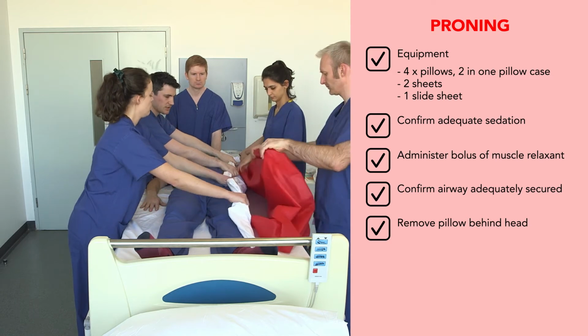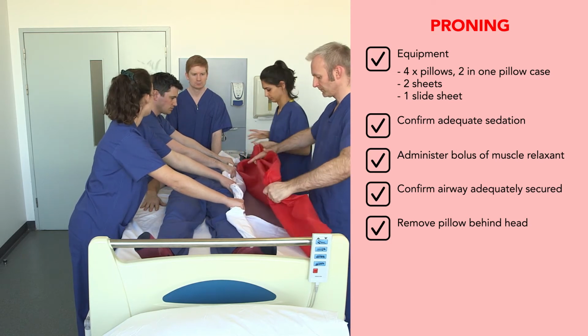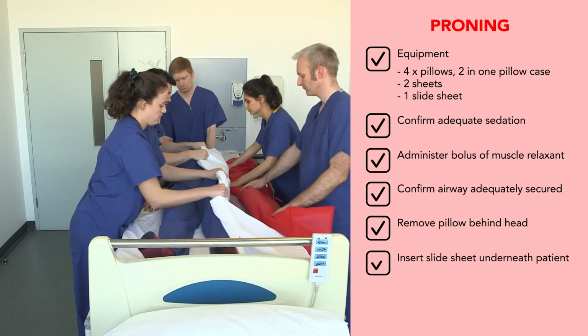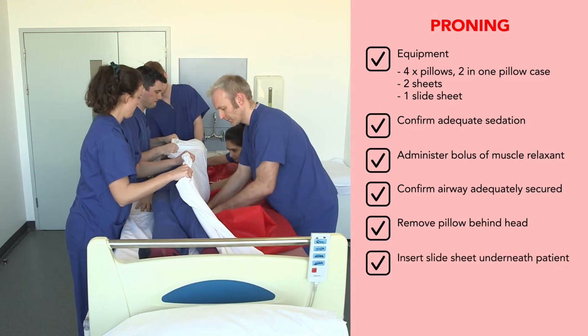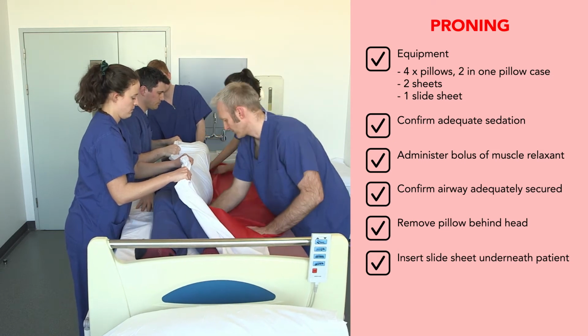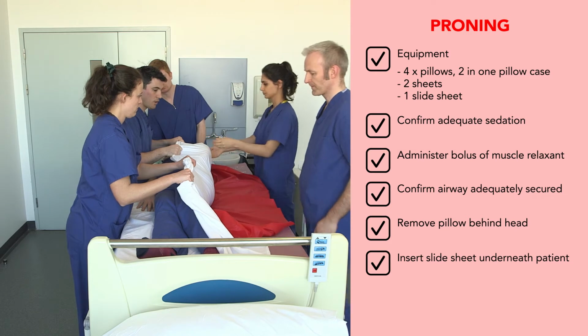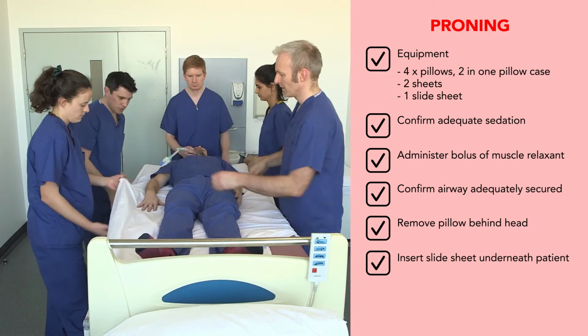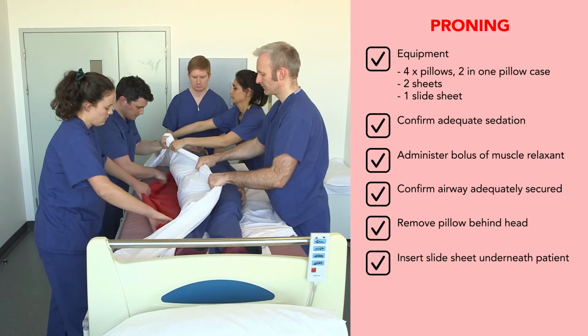We're going to tilt the patient towards us. Ready, steady, tilt. On back, ready, steady, back. And we should be able to reach through to find the sliding sheet.